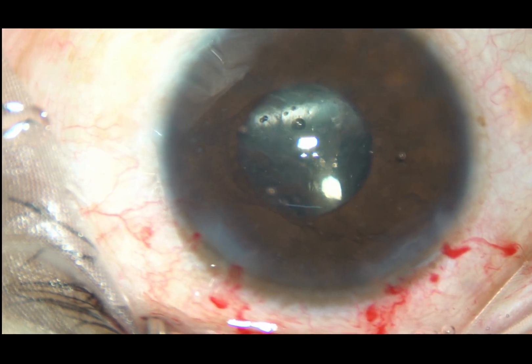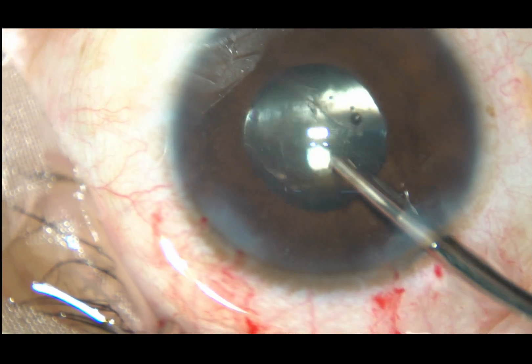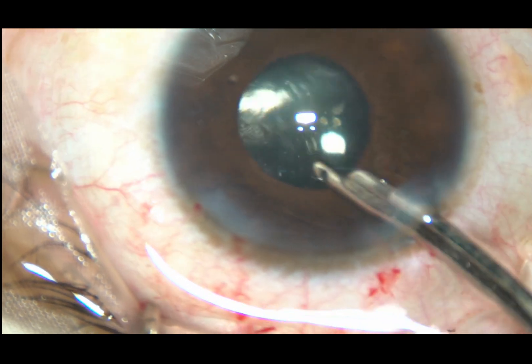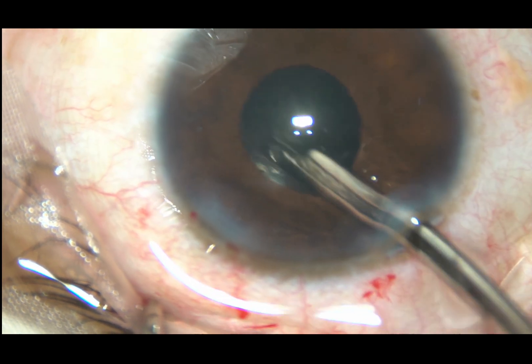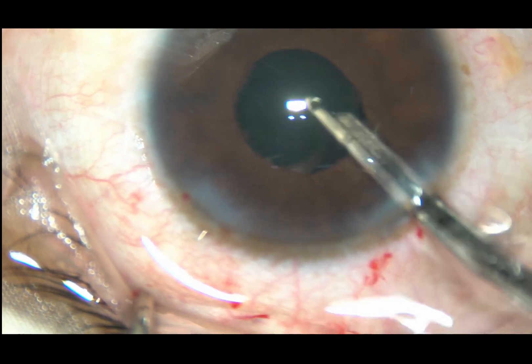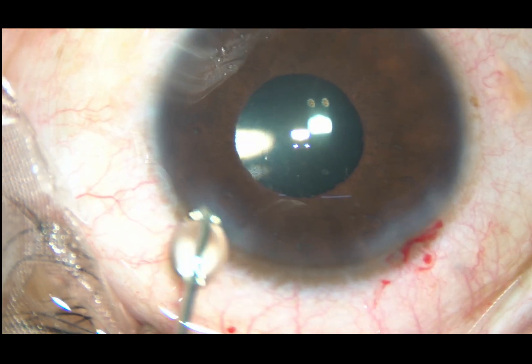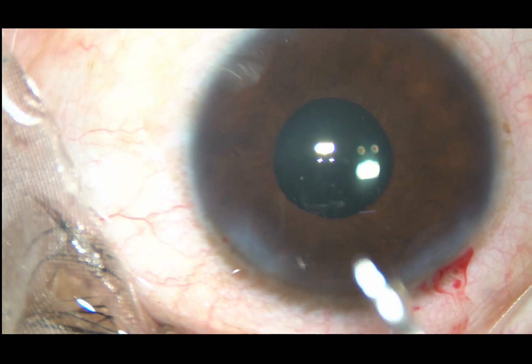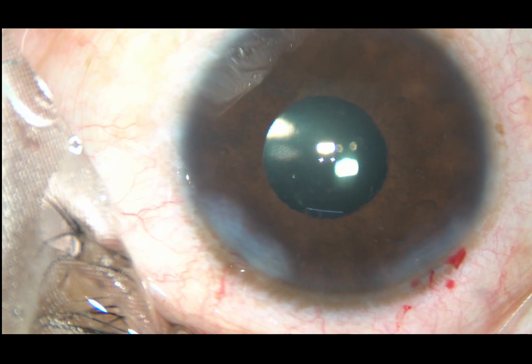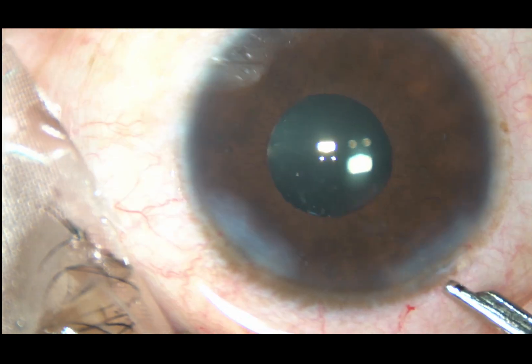Now the surgery is essentially done. We just have to clean the viscoelastic substance. All zones must be checked, and at this time viscoelastic substance from behind the lens is being irrigated out. There should not be any viscoelastic substance remaining in the capsular bag. After cleaning all the viscoelastic, the side port is hydrated and then final lavage of the anterior chamber is done with balanced salt solution.